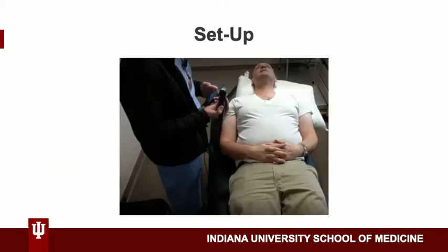Before you start scanning, have the patient lie supine with the neck extended. You can put a pillow under the patient's shoulders to help extend the neck. Next, choose the small organ preset on your device and put some gel on the probe. You can rest your arm on the chest for stability.